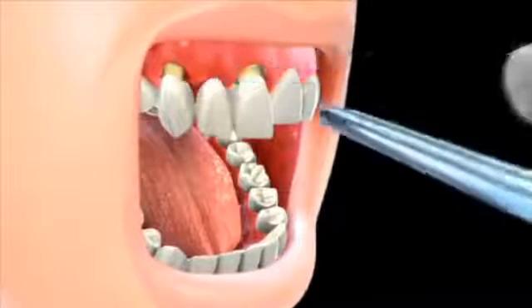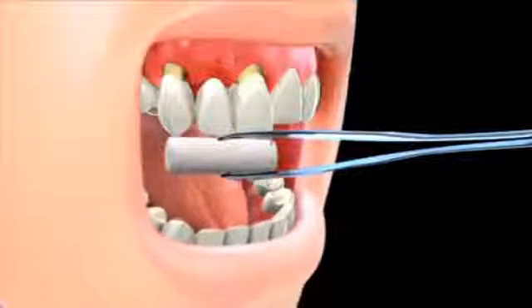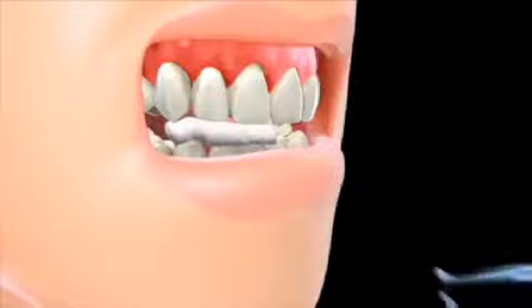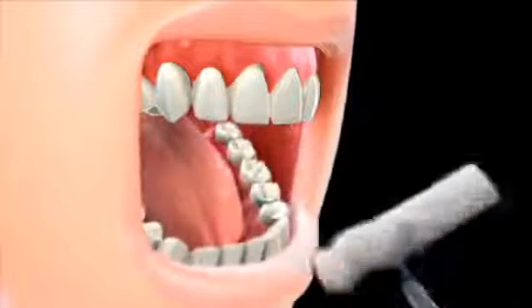Porcelain continues to improve, and in fact, there are newly developed porcelain materials, such as zirconium and Empress 2, that better withstand the forces of chewing. Porcelain bridges can give you the Hollywood smile that you're looking for.